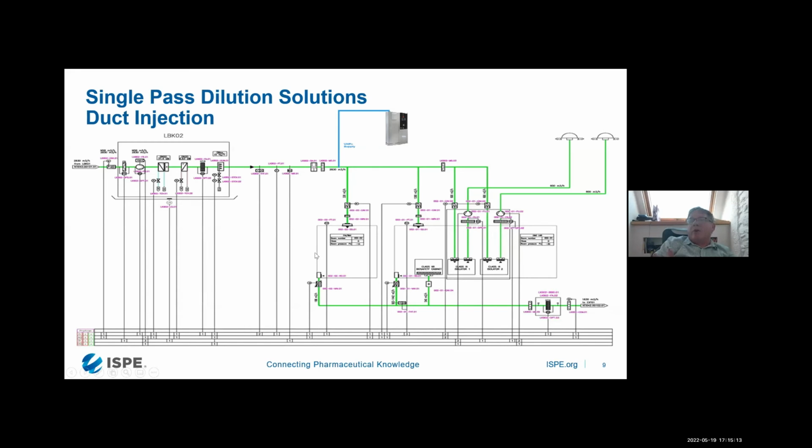So what we do first, we do that during our validation process. We make sure that we put enough aeration time to guarantee that below 1 ppm. But in some applications, we can also put sensors. We can put H2O2 sensors, which are sniffing the volume at the end of the cycle, and which are also putting interlocks on doors or interlocks on the process, so that nobody can re-enter the room as long as we are not below 1 ppm.